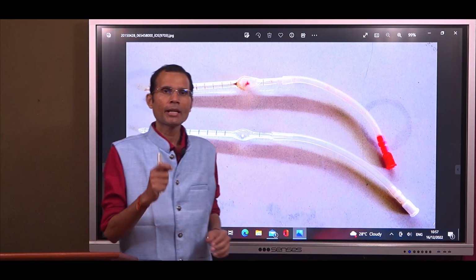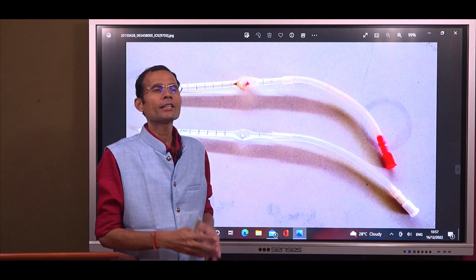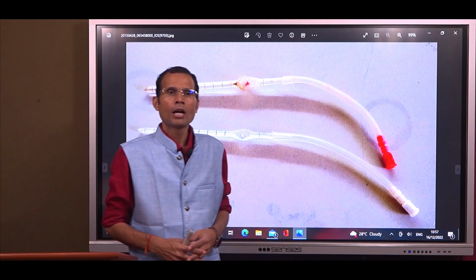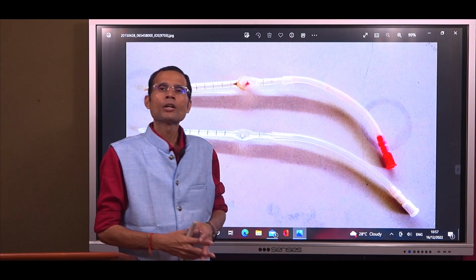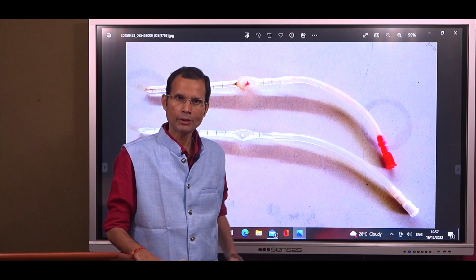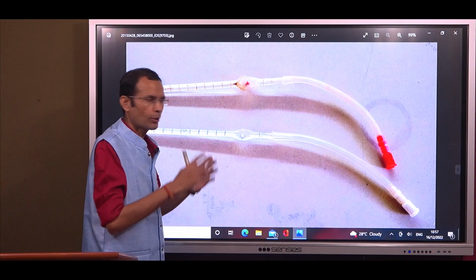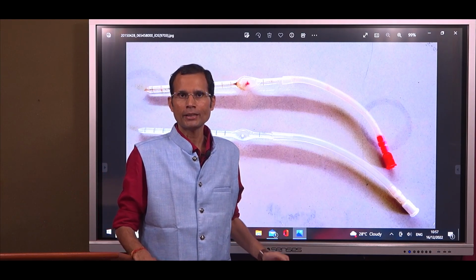Before we actually start, let me make a point. These methods are almost obsolete in the real world. I mean, in the real pathology laboratories, these methods are hardly in use anymore. However, in many medical schools, particularly in India, we still see these methods being taught at first year medical level, and therefore I thought I'll take up this topic and see what errors are made by the students. Right, so having said that, now let's talk about the dilution of blood.